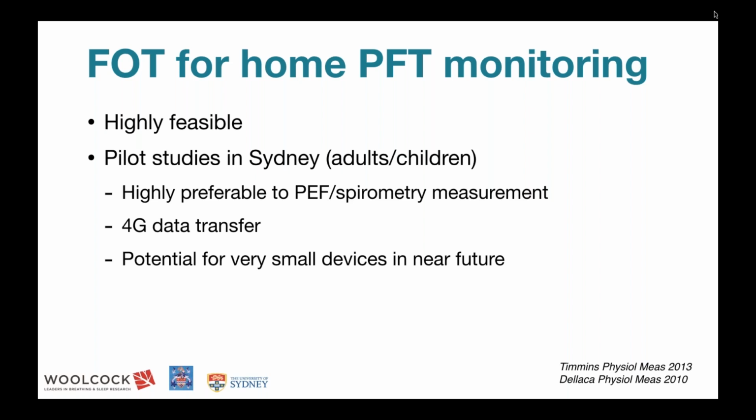The other advantage of this is that the devices that we're using, and probably many devices that are to come, allow immediate data transfer. So they come to a central place, and the complex analyses can be done straight away.